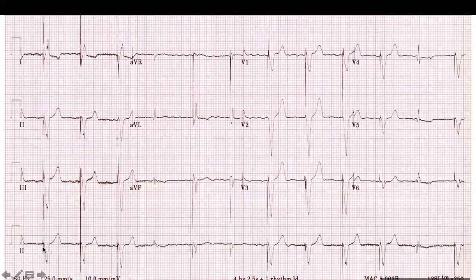One by one. So let's take the atrial last. So we'll talk about the ventricular. So we have 1, 2, 3. And then what is the fourth one? It's intrinsic. Okay. But we have a pacemaker. What should the pacemaker do? It should pace. Yes. So why is it not pacing?